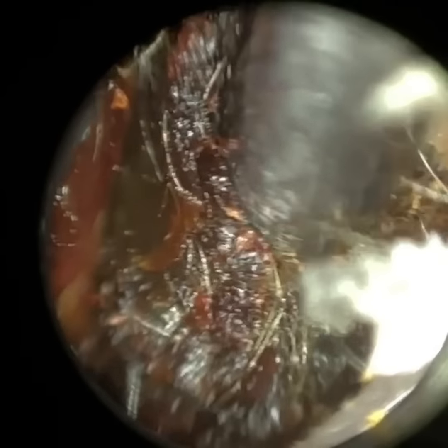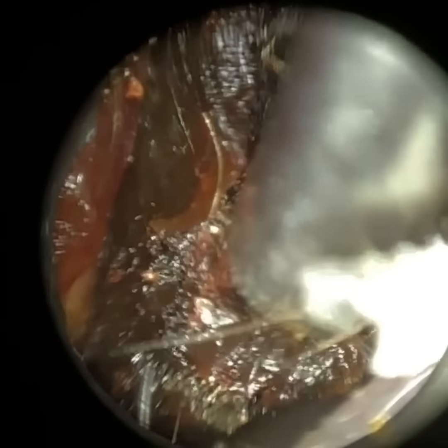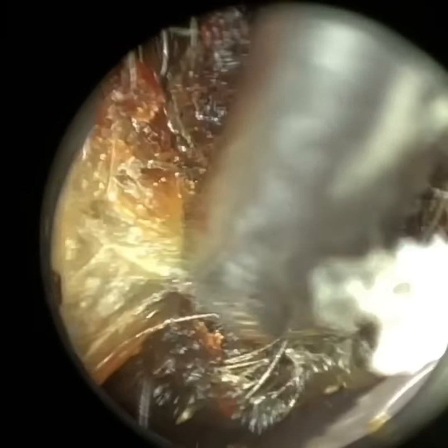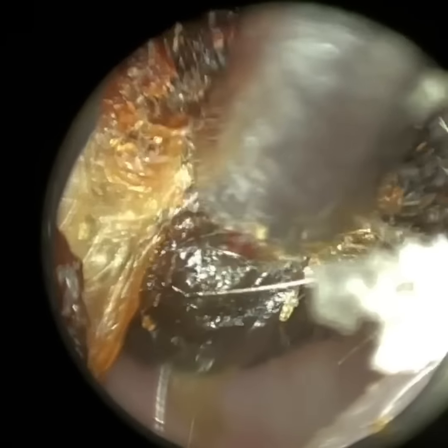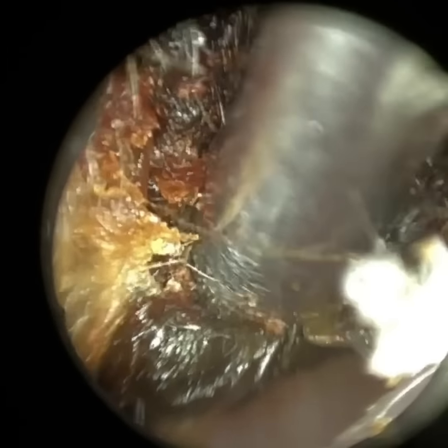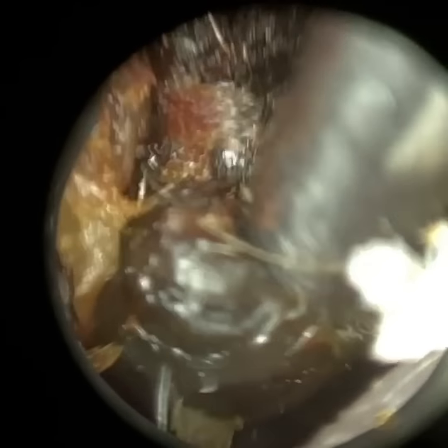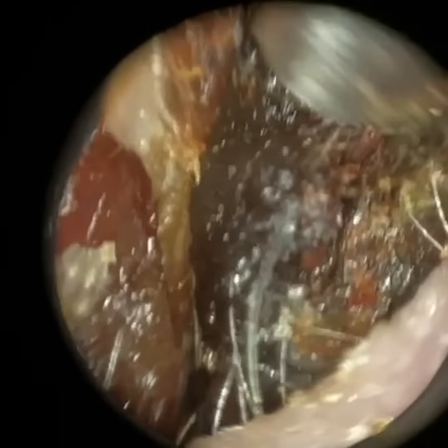The outer third of the ear canal is made up of cartilage, whereas the inner two-thirds is made up of bone. So whenever we stretch an ear open, we can't stretch the bony part — that's rigid. If the bony part is narrow, we have to work around that. But we do have some manoeuvrability with the outer third. In cases of bendy, twisty, or narrow ears like this patient, we can somewhat manipulate the outer third to stretch the ear open — and that's what the speculum is doing, widening the ear so I've got access with the suction tube to gently wriggle the wax out.